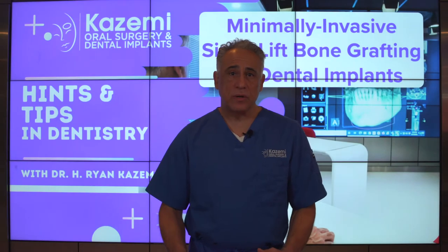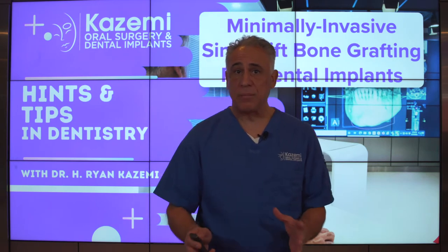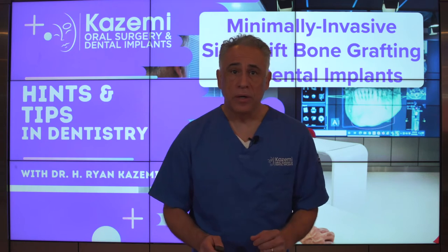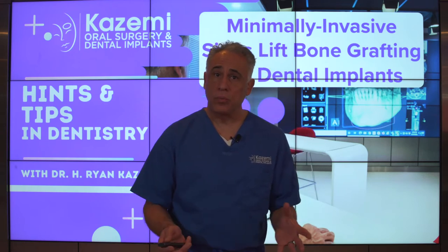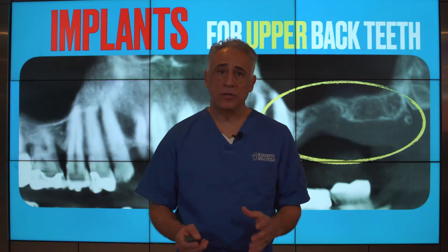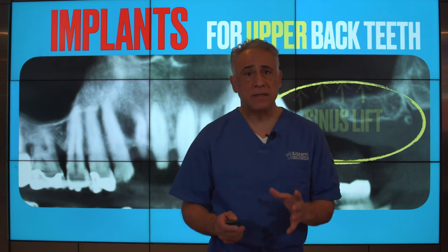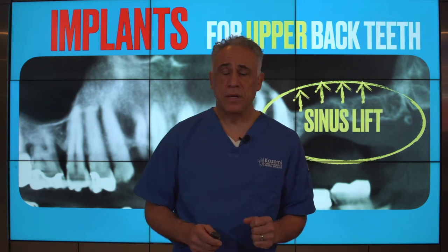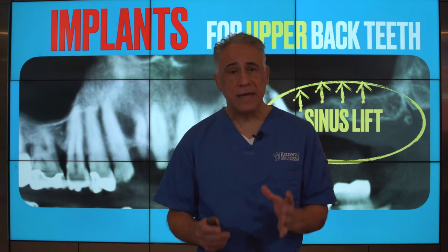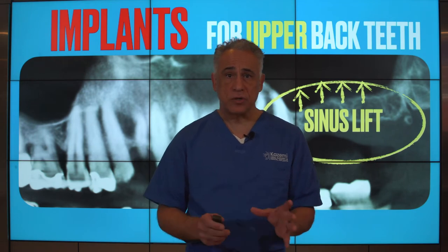In our last episode, we talked about how to prevent sinus perforations during dental implant placement, which can happen if there is insufficient bone due to sinus proximity or poor planning. A reliable and long-standing solution to bone deficiency in the back of the upper jawbone has been the sinus lift bone grafting. Does it work? Absolutely. And is it predictable? Yes. But it is considered a moderately invasive surgical technique.